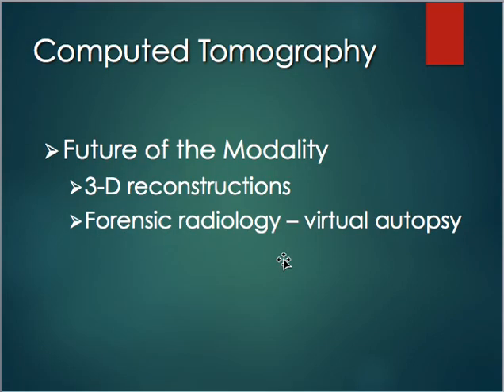The future for CT is huge. There's a large growth in CT that's coming. One of the biggest is 3D reconstructions. So they can actually take a scan and they can make a 3D reconstruction of it, which is going to be very beneficial for things like surgery planning so that we can see what's going on.